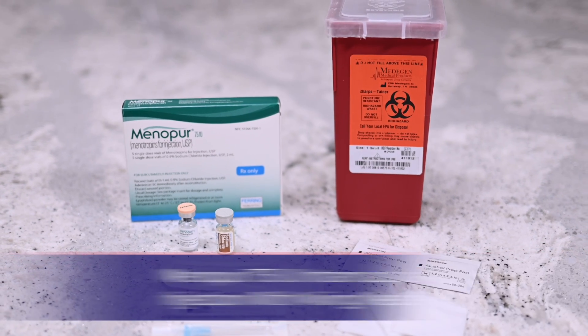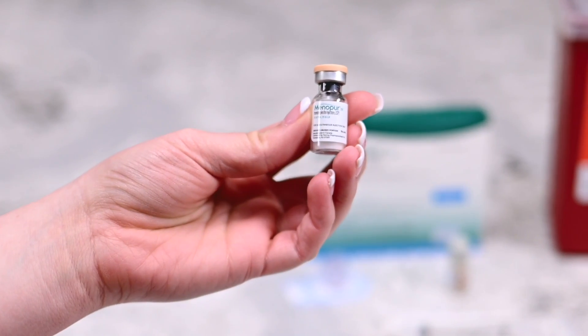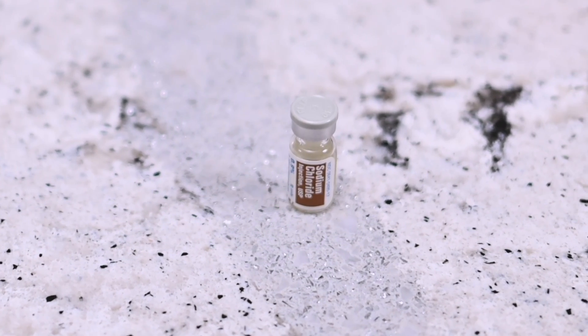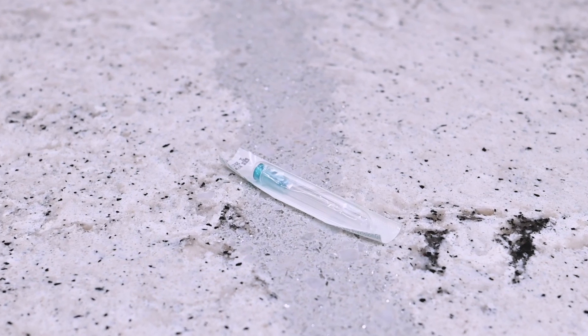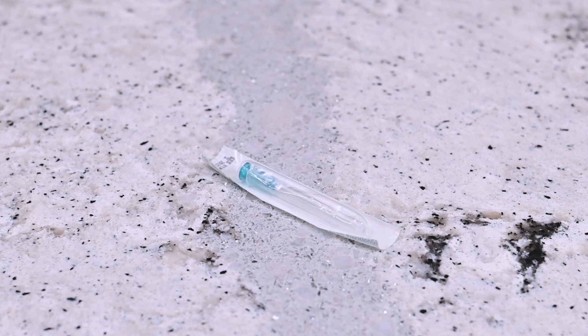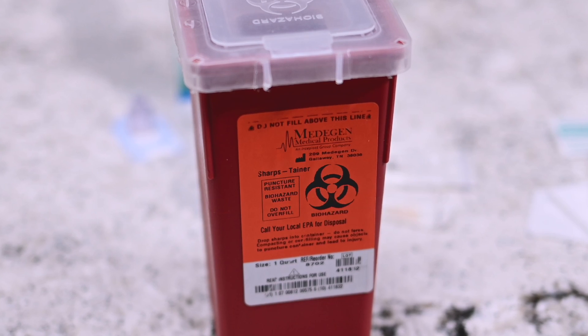You will need the following: one vial of Menopur powder, one vial of sterile diluent, a syringe with a 22-gauge one-and-a-half-inch mixing needle, a 25-gauge one-and-a-half-inch injection needle, alcohol prep wipes, gauze, and a sharps container.